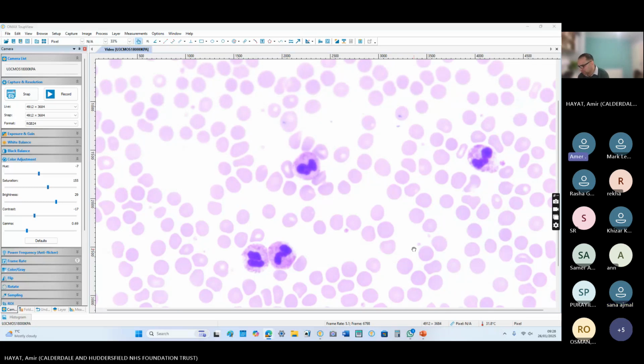It brings blast to the peripheral blood film, and the blast percentage increases falsely. So if your patient has GCSF injections and you have sent blood for flow cytometry, they will say the patient has 22% blast. And the MDS patient will be considered as AML now. It increases the blast percentage in the peripheral blood film. That's why we avoid GCSF in the AML cases or in MDS.